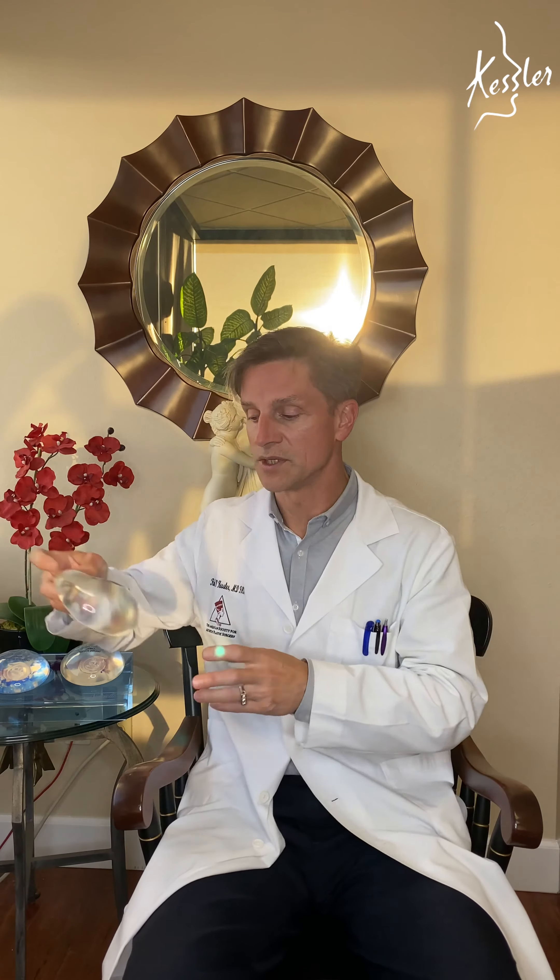Once that implant is ruptured and the silicone is in contact with the capsule, you can see capsular contracture — the hardening and changing in shape of the breast. Now with cohesive gel, that gel is bound to itself more tightly, so if the shell were to break, the gel would not leave the shell. The shell integrity can be broken but it won't change the shape of the implant, and the gel won't be in contact with the capsule, so theoretically the capsular contracture rate should be lower and we expect these will have better long-term survivability.